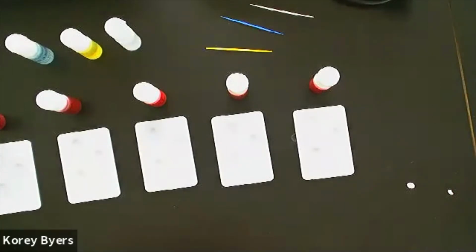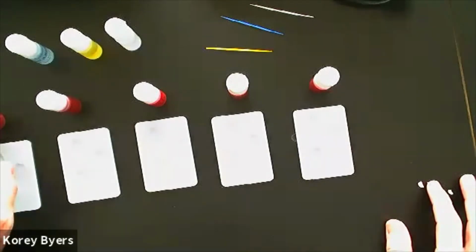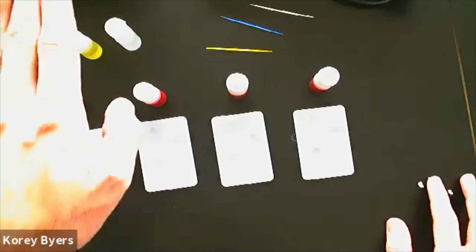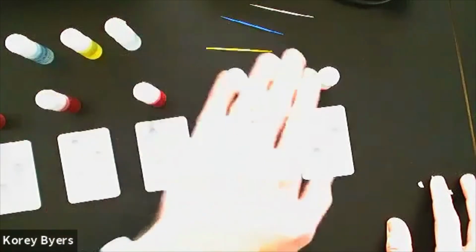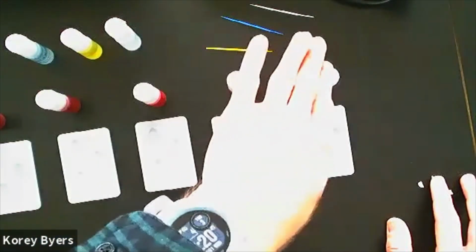We're doing types of sampling, blood testing. June has a daughter, Andrea, and she's pursuing child support. And we're trying to figure out who the potential father could be out of 3 different samples. Sample 1, sample 2, sample 3.